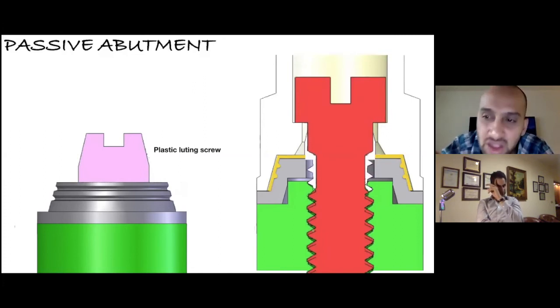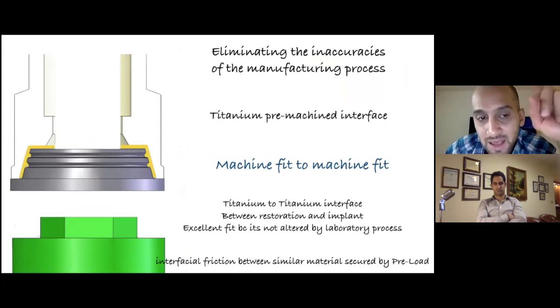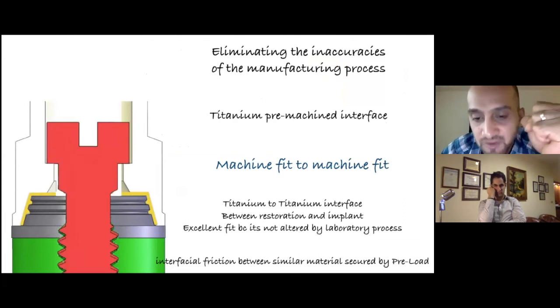Do you see the edges of the screw on top clamping the prosthesis to the fixture? And all that titanium ring that you saw is acting like a washer, right? And the prosthetic screw is clamping the final prosthesis to the implant and clamping that cement space. Bear with me, and you can ask a lot of questions about this and we'll understand it. But what it is doing is that the passive abutment is attached to the prosthesis with that yellow cement line. But because of the clamping effect of that prosthetic screw, boom, it brings it down and then the prosthetic screw clamps the final prosthesis.